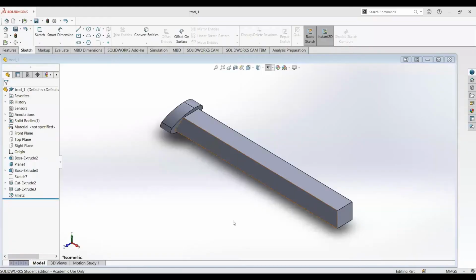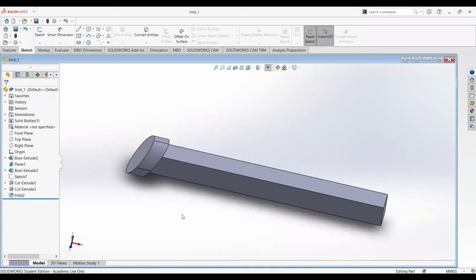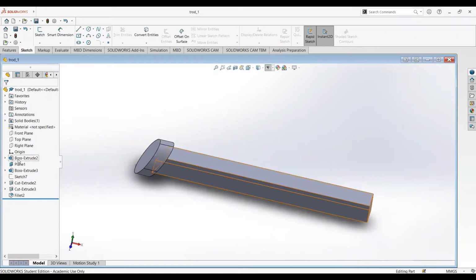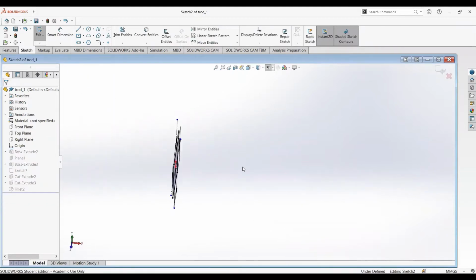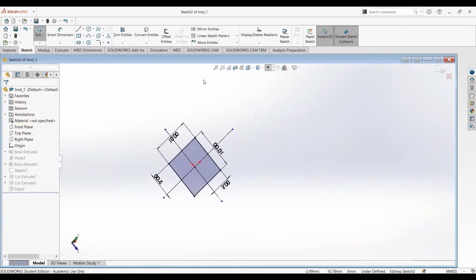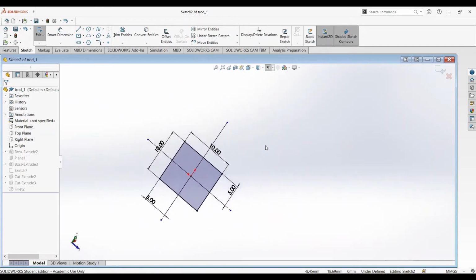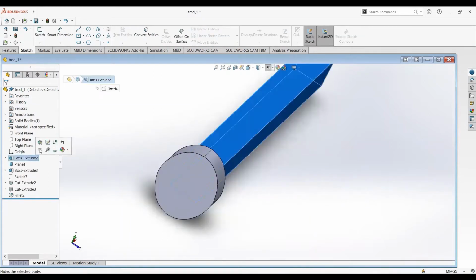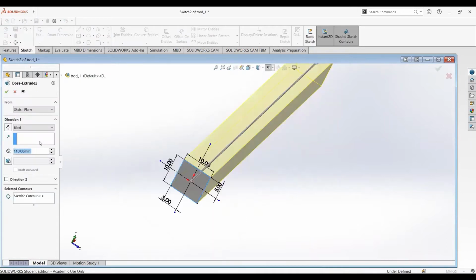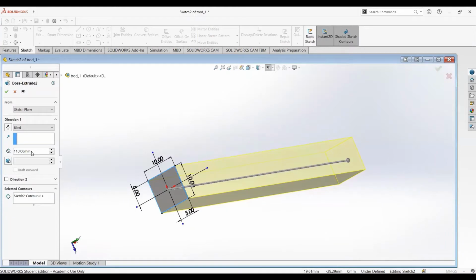Okay, this is another part that was needed for our device. We call it T-shaped rod. Let's go through how we made this part. So first we sketched this square right here, all the dimensions. As you can see, let's zoom out so you can see the next step. After that, we extruded this right here by 110 millimeter, as you can see right here.